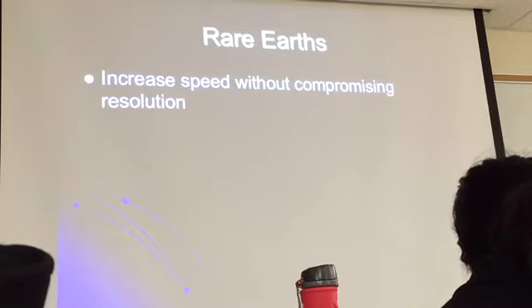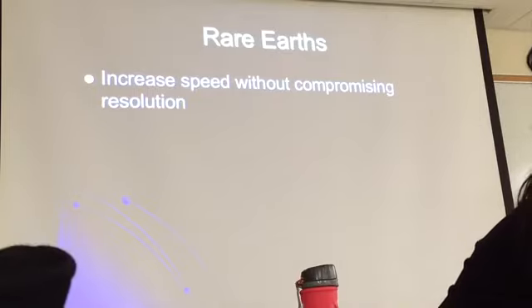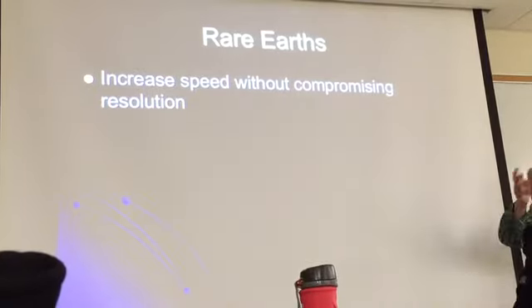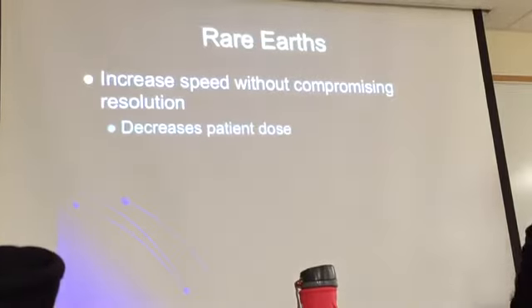But they have other qualities that help in improving other areas. Better contrast, better brightness, all of that. And you can manipulate it. So all of that has some advantages. But when it comes to strictly resolution, it's not better.